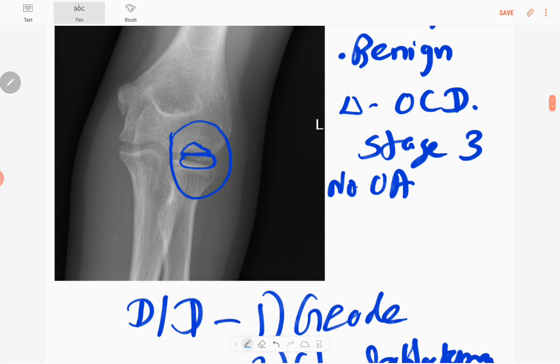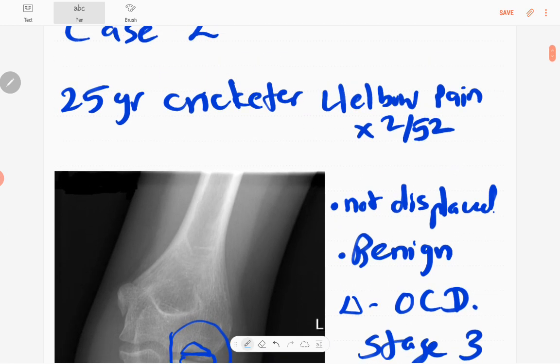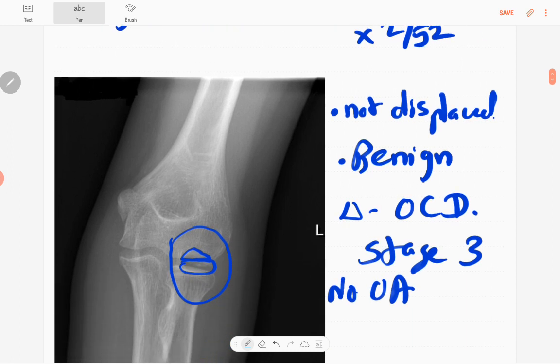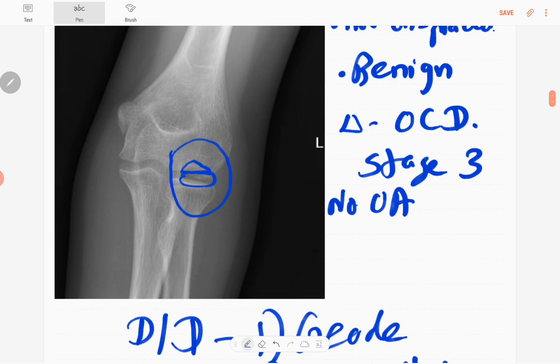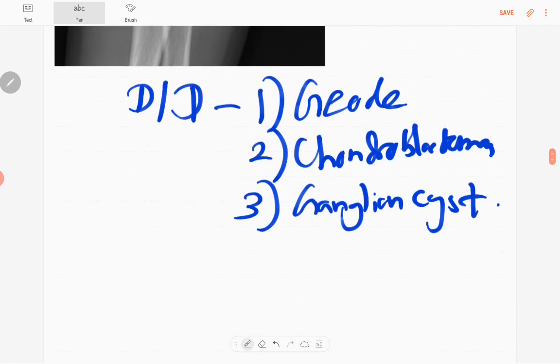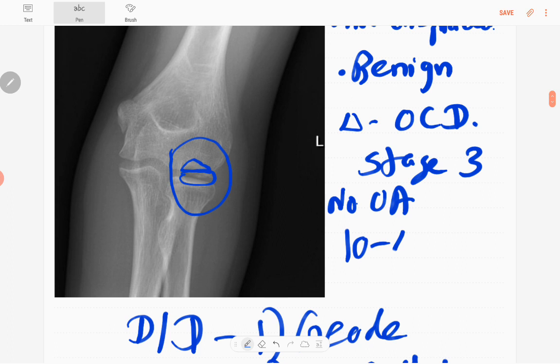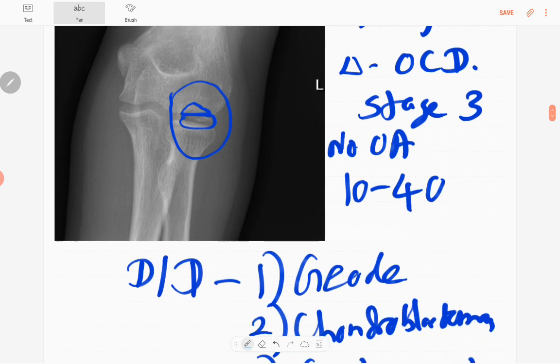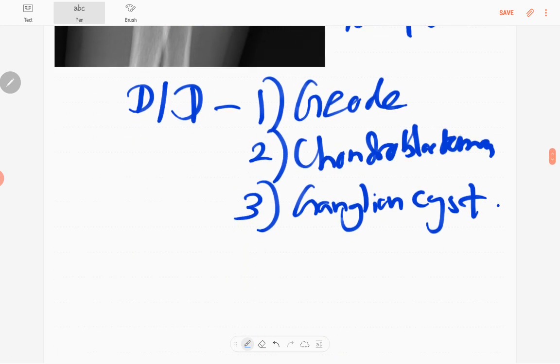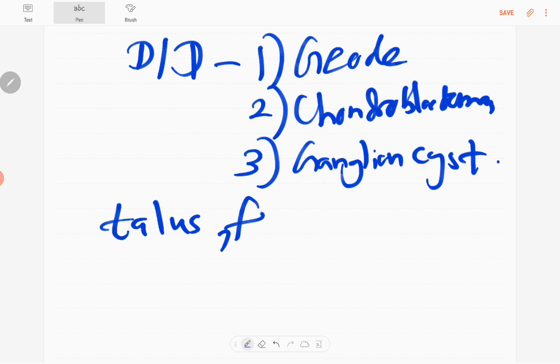Considering the age of the patient and being a cricketer, the most likely diagnosis is osteochondritis dissecans. It is more common in the 10 to 40 years age group. Other sites include the talus, the knee joint, and the femoral condyles.